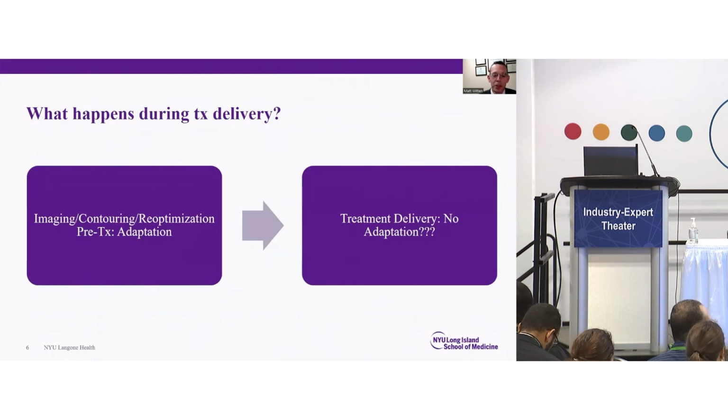What happens during treatment delivery? We have imaging, contouring, and re-optimization pre-treatment. So we have adaptation there. But then during treatment, we don't have any adaptation to how the anatomy might be changing during the fraction, intrafractionally.